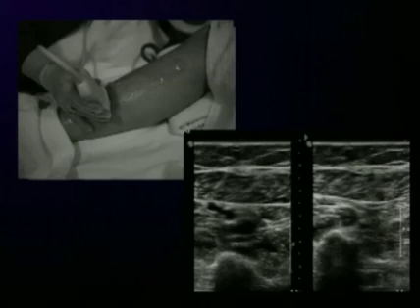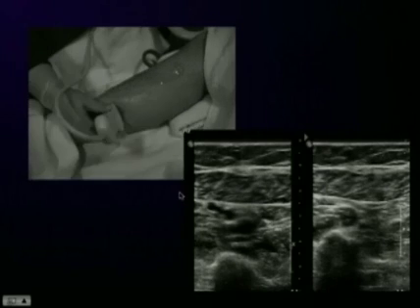Now, when doing the calf scan, we like to start from the foot and progress centrally, and having your hand in this position will allow you to augment with your pinky while doing the examination, especially when you have trouble finding the veins. This also allows you to angle the probe in order to look at the posterior tibial and peroneal veins without repositioning the patient.